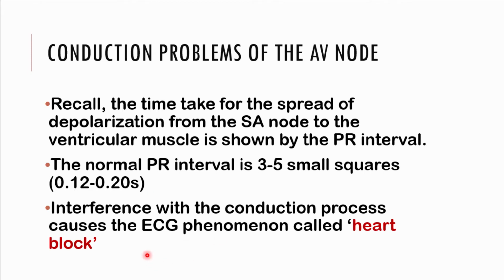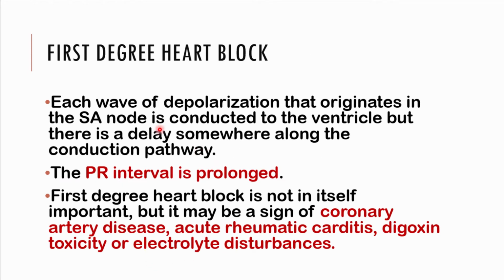So you refer to that as heart block. You have three degrees of heart block: first degree, second degree, and third degree.